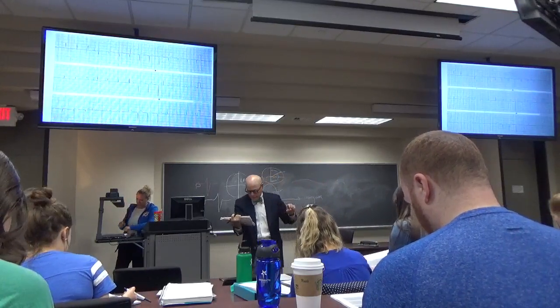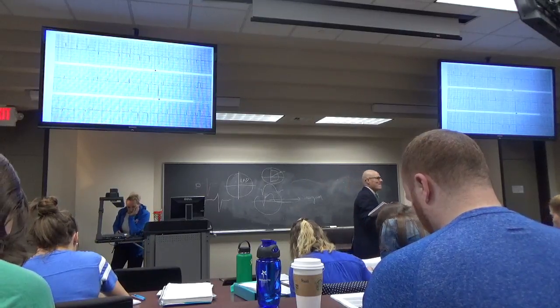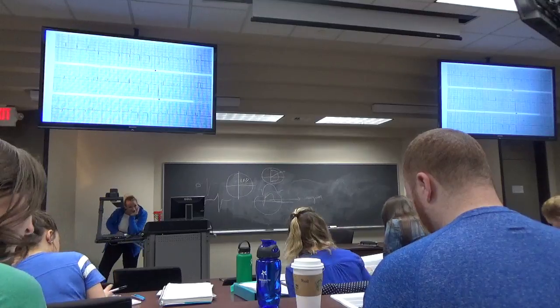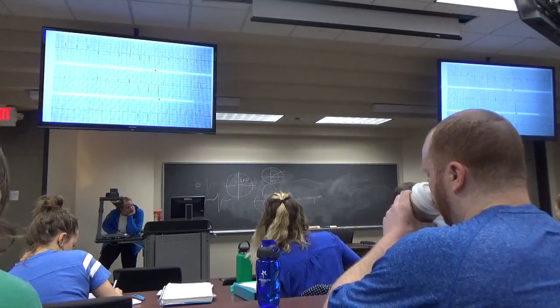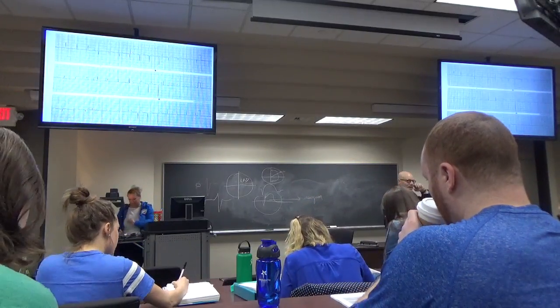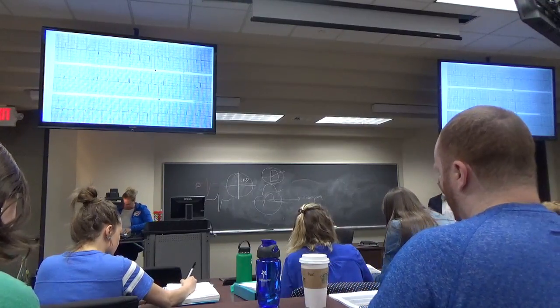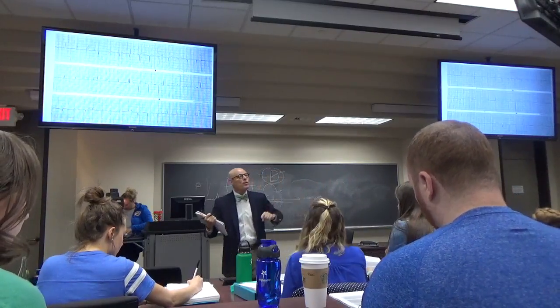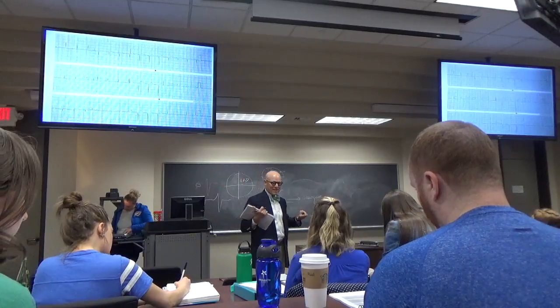So how about the Q wave in lead three? In three, they're free. I like that. That's what Jacob said? No. Someone else. Oh, in three, they're free. That's good. If it's isolated in three, it's free. It's not important. So what does isolated mean? It's not there in two and aVF. It's not there in its siblings. So we don't worry.